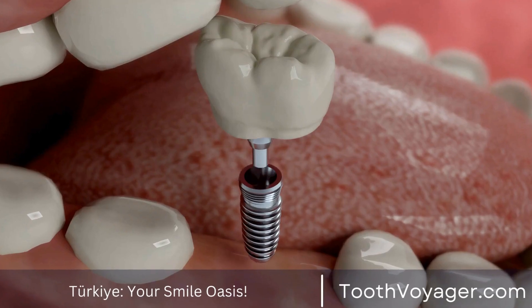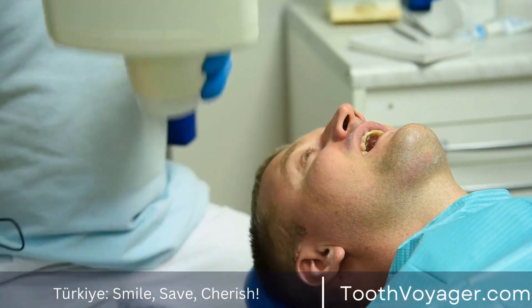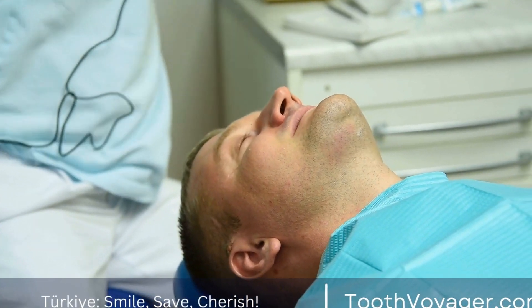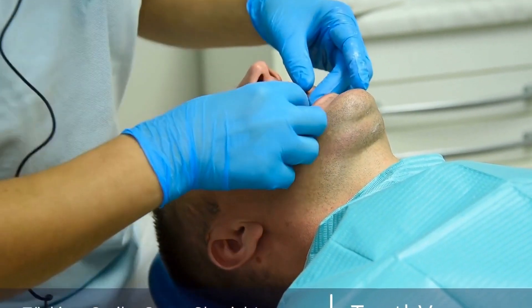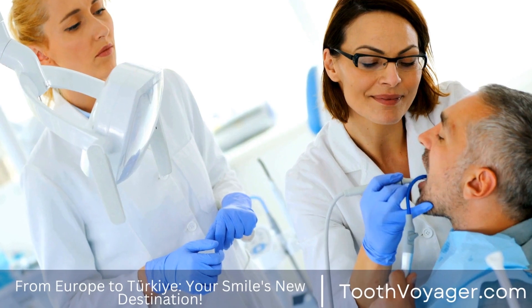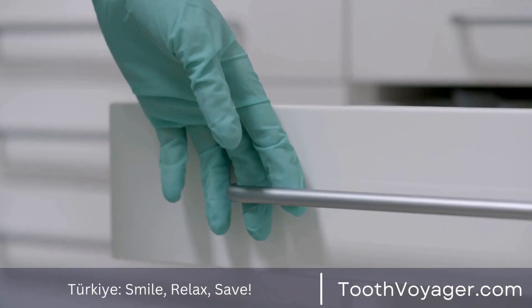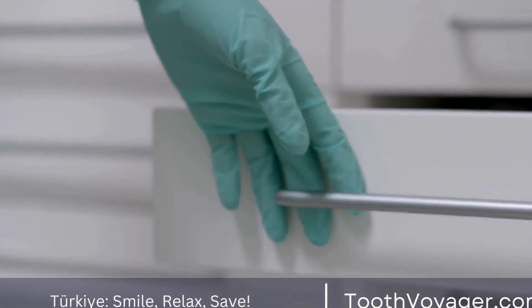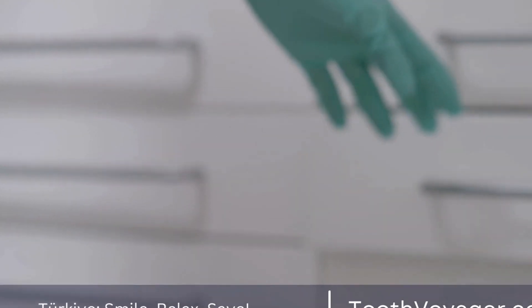Types of dental x-rays. There are several types of dental x-rays that dentists use to evaluate different aspects of oral health. The most common types include bite-wing x-rays, which are used to detect cavities between teeth and assess the health of the supporting bone structure.